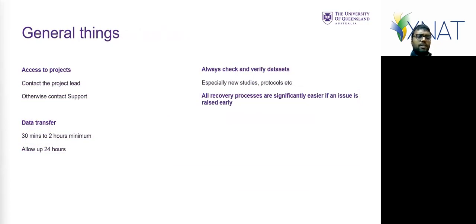In general, if you're in a project team and want access to your project, contact your lead. They'll add you if they're the project owner. The data transfer takes a minimum of about 30 minutes to 2 hours, depending on how much load there is on the transfer. It can't be shorter than 30 minutes because we need to leave the data on the server for about 30 minutes to see if new data is coming in or not, because there's no clear way to tell whether DICOM transfers completed an entire scan except for the time heuristic.